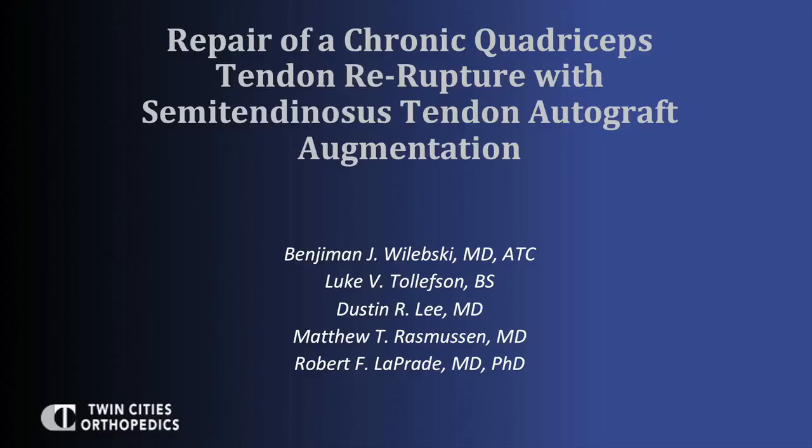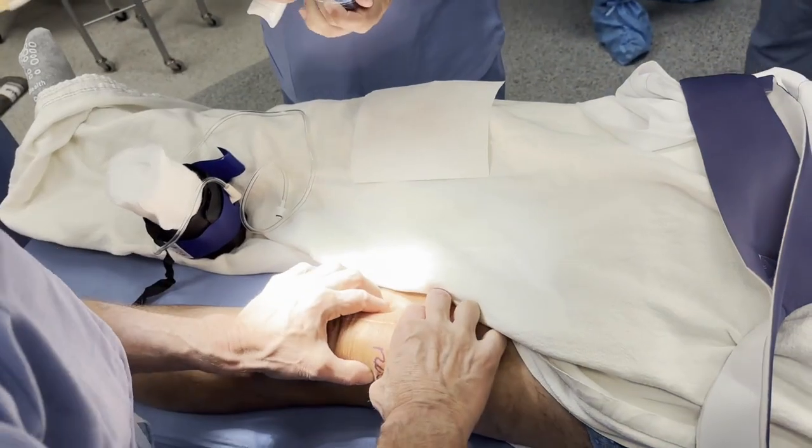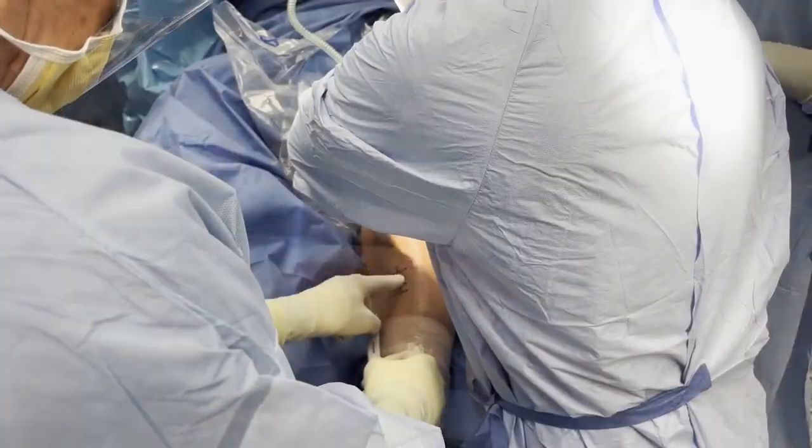This is a video technique for a repair of a chronic quadriceps tendon re-rupture with semitendinosus tendon autograft augmentation. The disclosures for the senior author are listed. The patient is positioned supine on the operating table and induced under general anesthesia.